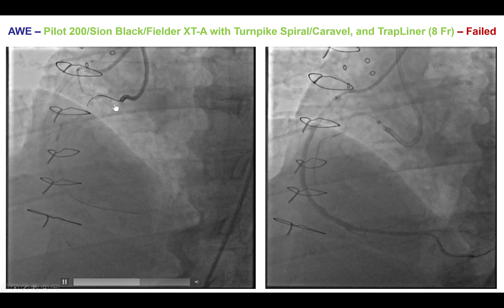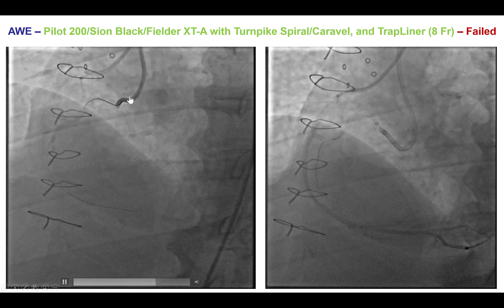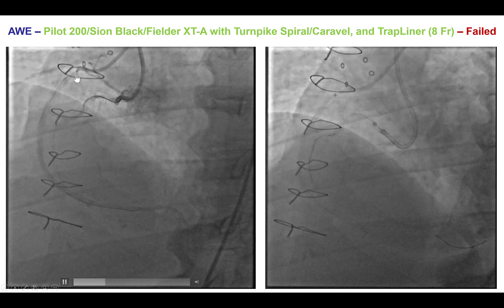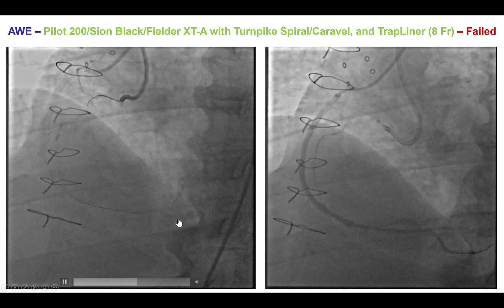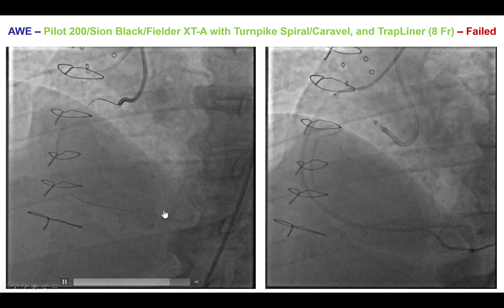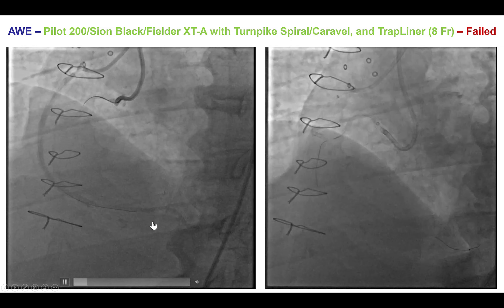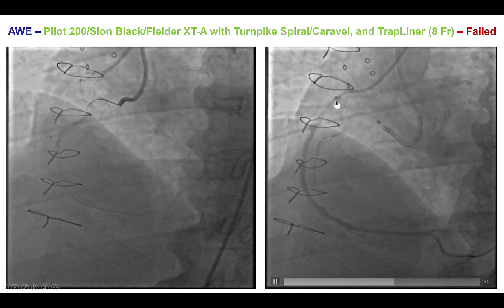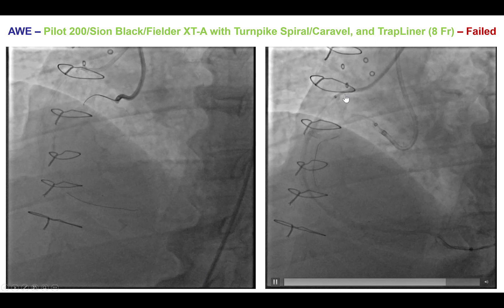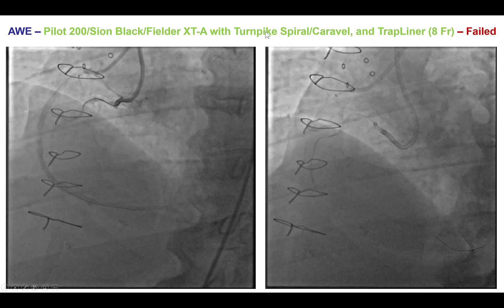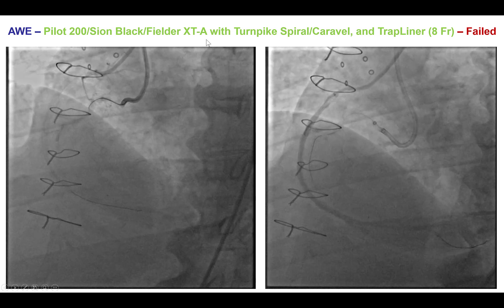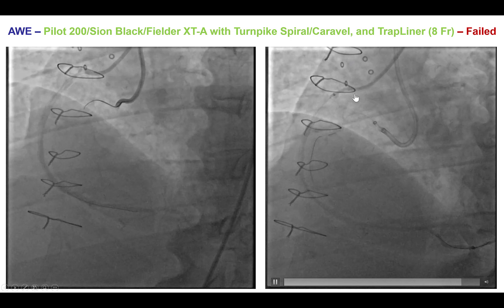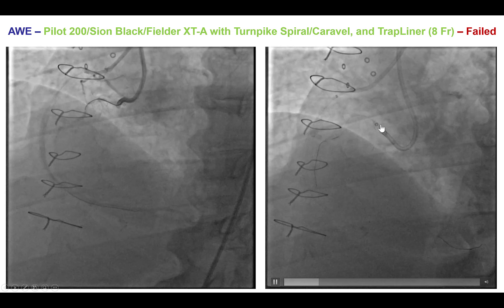An AL1 guide was used to engage the right coronary artery, and a JR4 to engage the SVG to the right. A safety wire was placed in the SVG to the right coronary artery, both for safety and also for illustrating the location of the distal vessel. Antegrade wire escalation was then performed using multiple microcatheters — Turnpike Spiral, Caravel — and multiple wires including Pilot 200, Sion Black, and Fielder XTA, with a Trapliner guide extension.